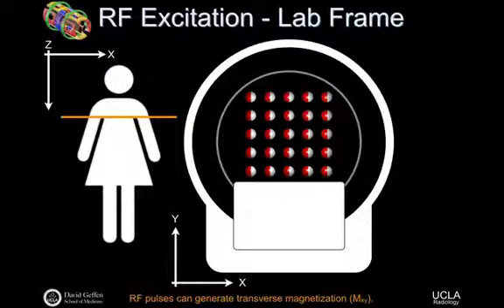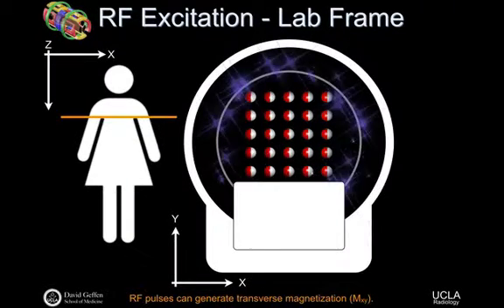The sort of middle third of this class is how do we interpret that signal to begin with. So this is the process that we want to describe today. How is it that RF energy can tip the spin system over? And that's kind of qualitatively the picture you can have in mind.